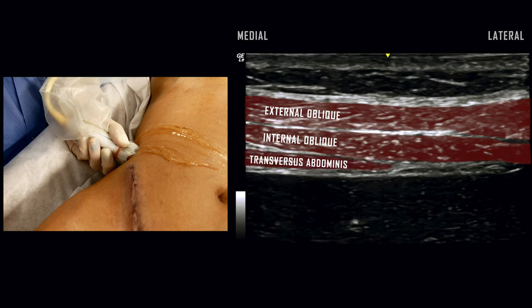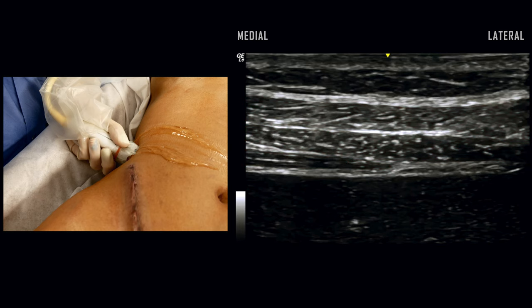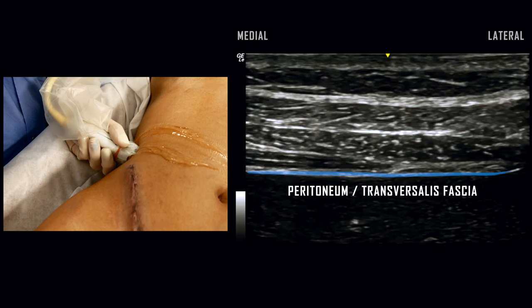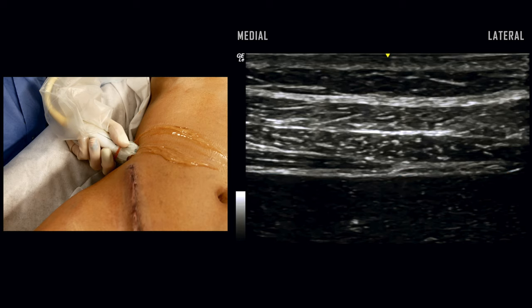The peritoneum and contiguous transversalis fascia are visualized as a hyperechoic structure deep to the transversus abdominis muscle. The needle target is the neurovascular fascial plane superficial to the transversus abdominis muscle. This plane contains the thoracoabdominal nerves that innervate the lower abdomen.